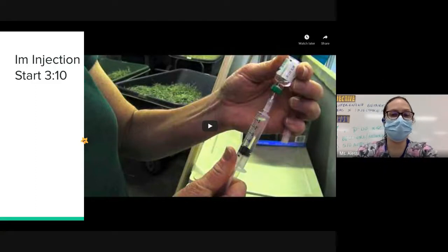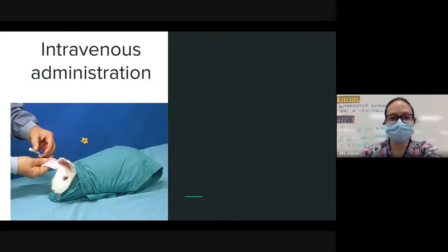Same thing going into the skin. If I go into the skin, I've dulled the needle. I want to change it out if I have to do a re-injection.